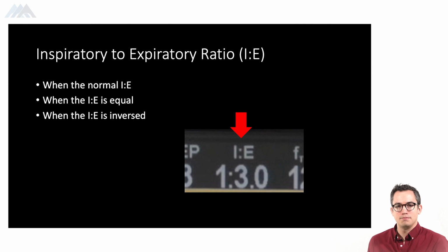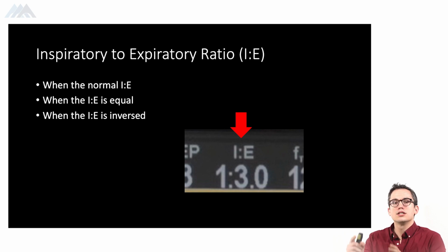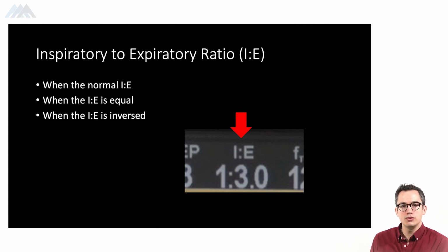than you're taking a breath in. But for different reasons, if patients were having difficulty oxygenating and you increase their inspiratory time for that breath, you're going to bring that ratio of inspiration to expiration closer together. So what that's going to do is you're going to inspire, hold that breath in longer, allowing for more oxygen to diffuse across those alveolar units before you're exhaling.